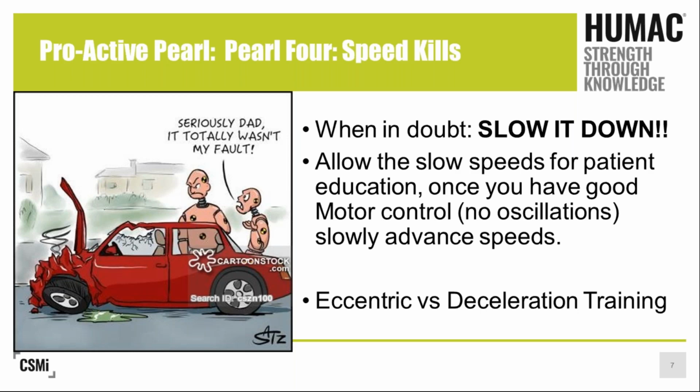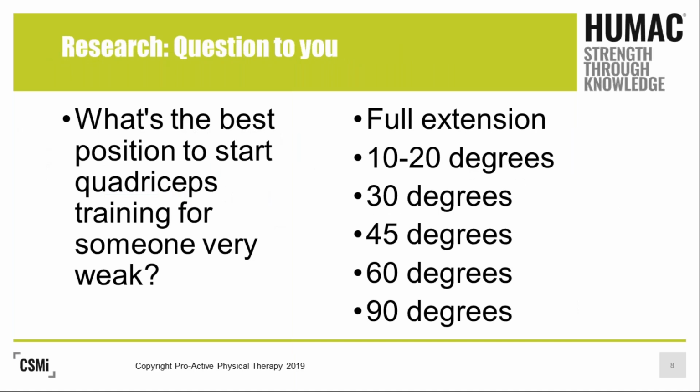What do slow speeds for your patient actually do? You have better patient education because you're going to be able to motor plan a little bit better. You don't want the oscillations. You don't want them having issues or discomfort associated. You want it to be slow and steady. You want them to have good motor control, meaning time to kind of get the feedback back so that they're loading appropriately. And we're really going to talk about this again next month when we get into eccentric and deceleration training with strengthening aspects and the components that we need to look for.